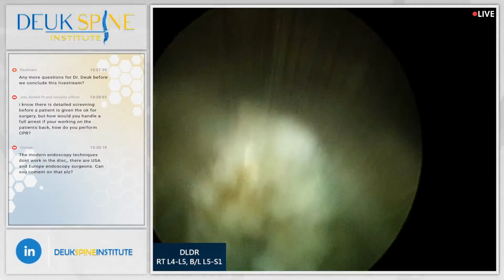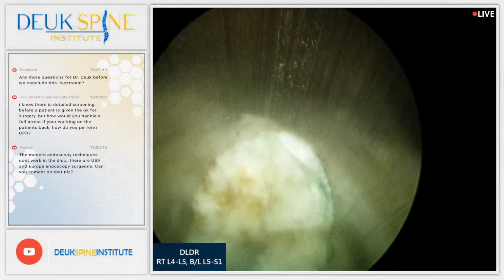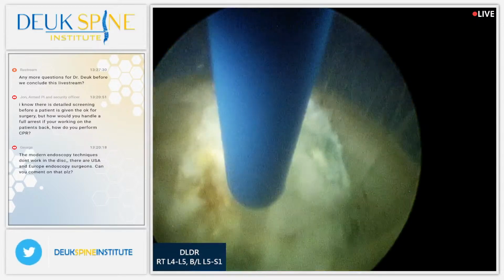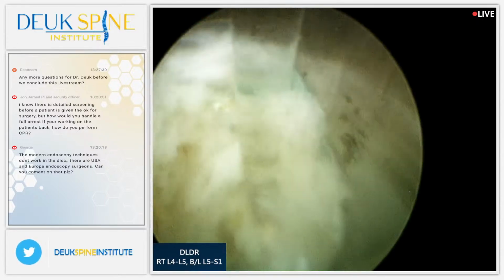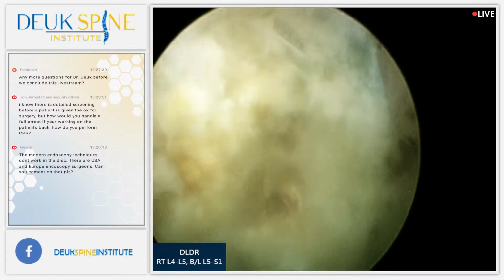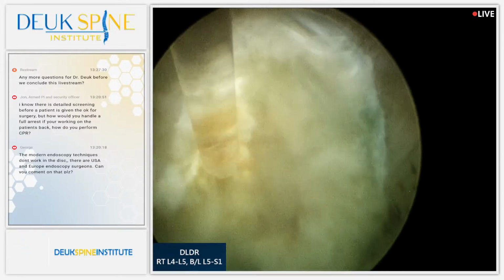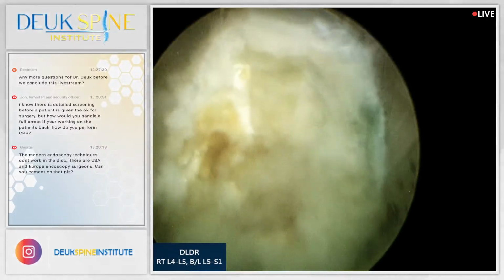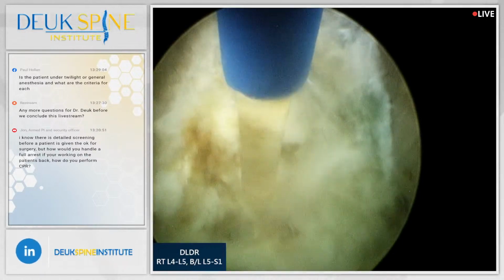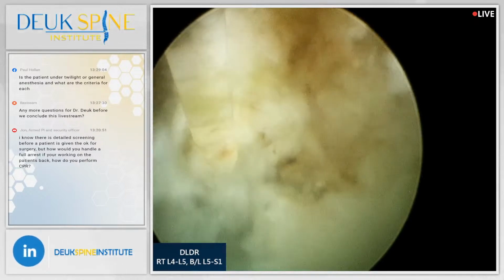Look at that piece of herniation. You guys see that snowball that came up? Yes, we did. Hopefully it's up and out, but we'll see. All this is herniation here. Very scarred. All that white stuff is scar tissue around the herniation, encasing it like concrete. This is what bulges out backwards towards the nerve and pinches the nerves. This is what causes spinal stenosis. All this stuff here.